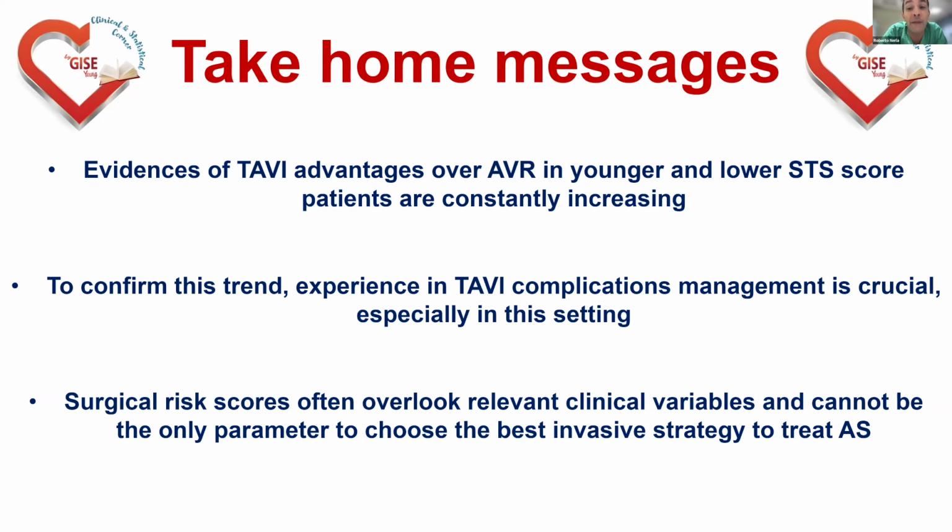But you have to take it into account because, although we don't have perfect evidence, different evidence is coming to the same point: patient prosthesis mismatch can reduce the durability of the valve and bring more valve dysfunction to our attention, thus increasing the risk of having a TAV in TAV before the period you would like.